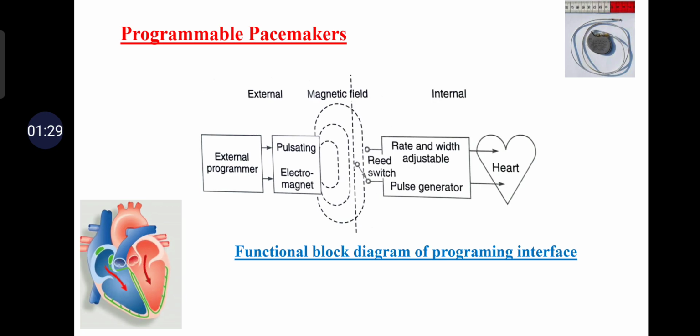Usually, an essential requirement of programmable pacemakers is that they should be immune to accidental programming from naturally occurring energy sources. So to meet all these requirements, the information is usually coded, and the pacemaker contains a decoding mechanism to recognize the properly given information. So this programming security code method makes it practically impossible to reprogram an implantable pacemaker through extraneous random magnetic fields. Okay, so this is all the important discussion while going for the programmable pacemaker.